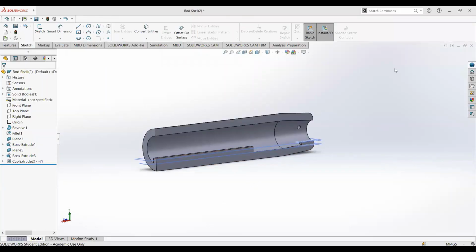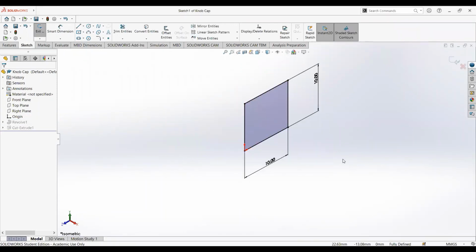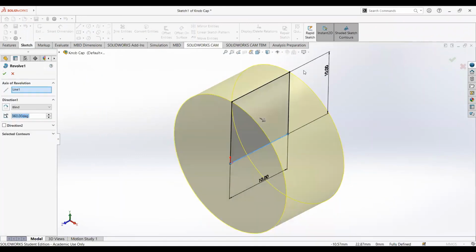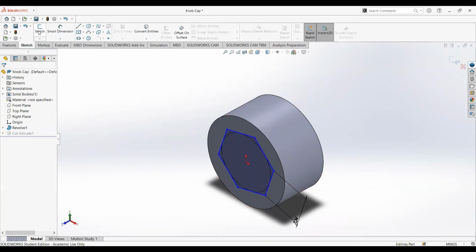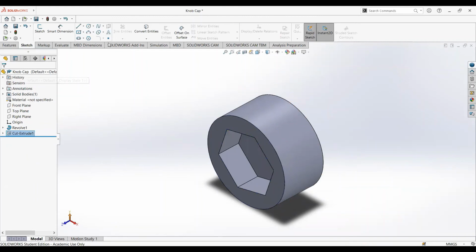Let's move on to another part really quick. So this is a knob. This is because we're going to put a screw and a knob in our device, and this is the knob cap. This is very simple. So firstly, you sketched this 10 by 10 right here. After that, we use revolve, as you can see, 360 degrees. And then we sketched this, 7.34. After that, we cut extruded that part to give this shape so we can put the screw right here. Yeah, this is how we created our knob part.